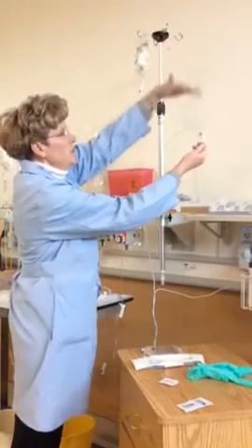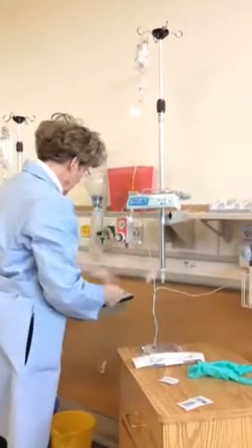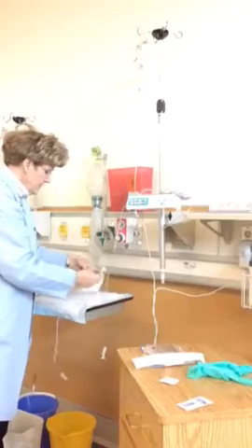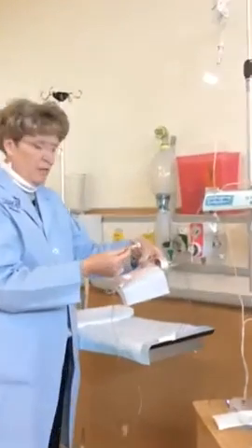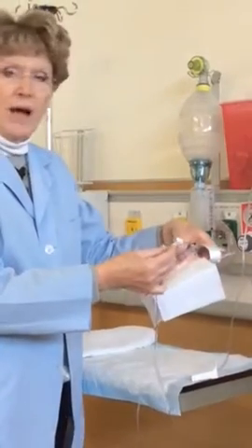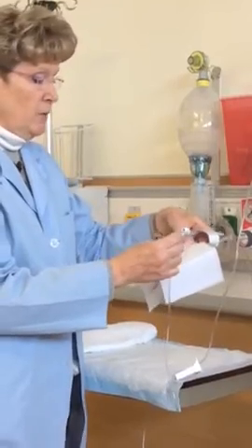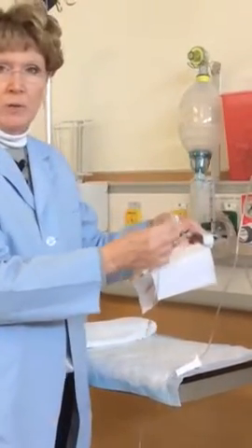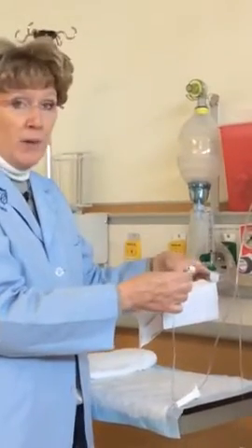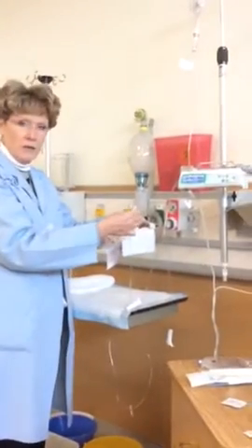If I plug something in here, the pump is going to draw it in. There's also a port all the way down here. I'm going to lift up Casey's arm here a little bit. There's also a port very close down to the IV site. This port is where we access to do IV pushes. If I put my secondary line in here, it would be directly from the bag to the patient and would bypass the pump. So that helps you make sense of it. We need the pump to pump in our IV piggyback. We don't want it to run in by gravity.